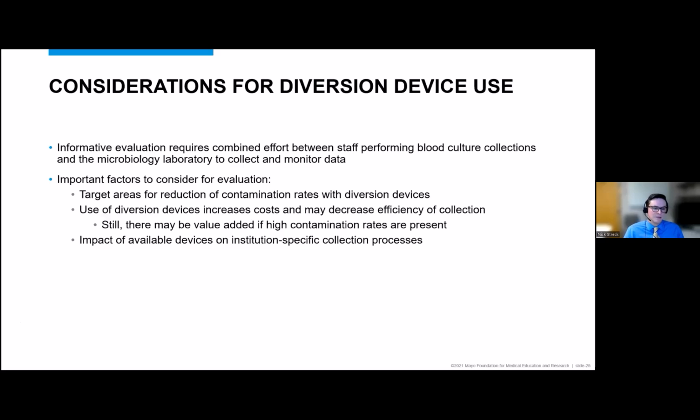So there are some things you have to consider when looking at these devices. The evaluation really needs to be a combined effort between the staff performing the blood culture collections and the microbiology laboratory, so that we get the appropriate data and the appropriate people involved to make sure we're studying the effects of these devices appropriately at different institutions.